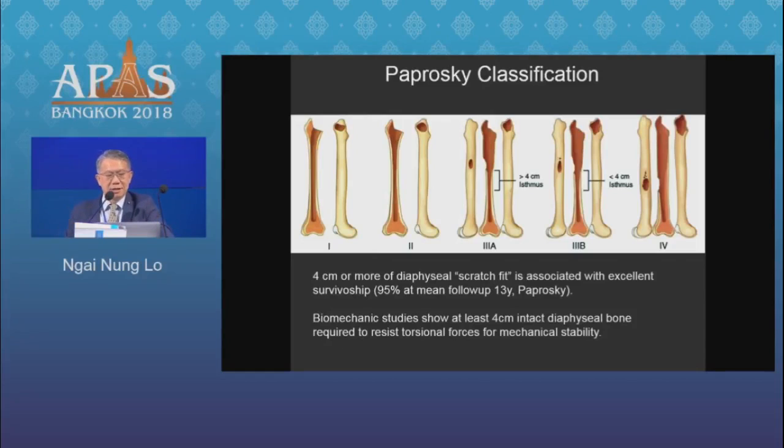And it is type 1 to 4. Type 1 is basically where the metaphysis, the proximal femur, is still well preserved, and there should be no problem revising this with a standard total hip implant. This would be a case like where we're perhaps revising an ASR resurfacing hip implant, and you saw off the neck and the proximal femur remains good.